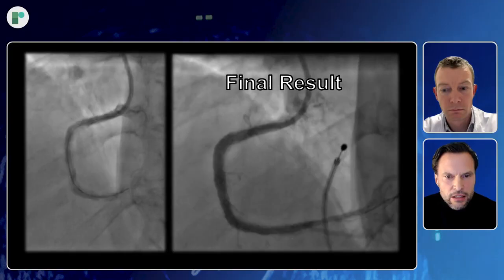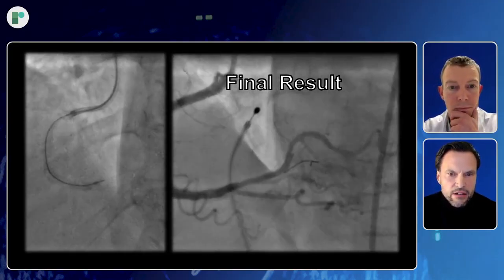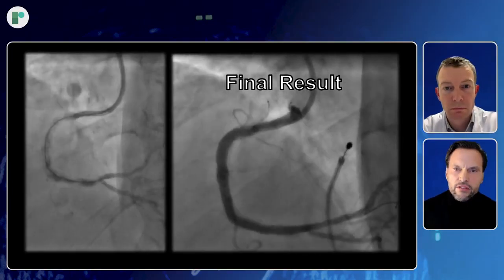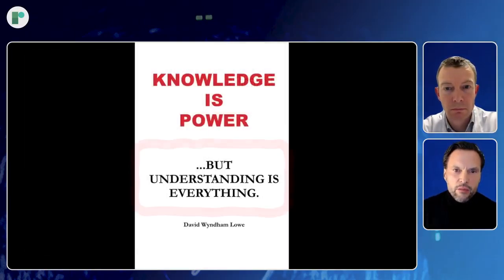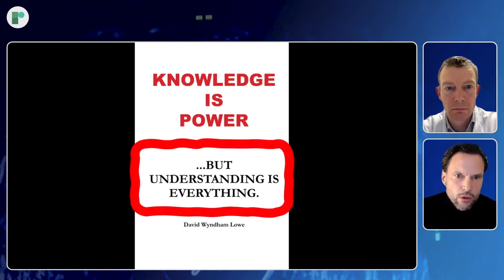To really use those tools well in every patient and to decide what to use, we must have this information available. So it's important to really know what is going on there. For a good treatment, to decide what is best in every case, it's really important to understand the disease, and thereby it's extremely helpful to have all the information available from intravascular imaging.